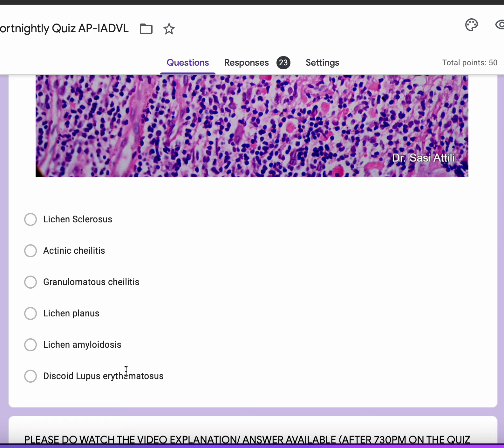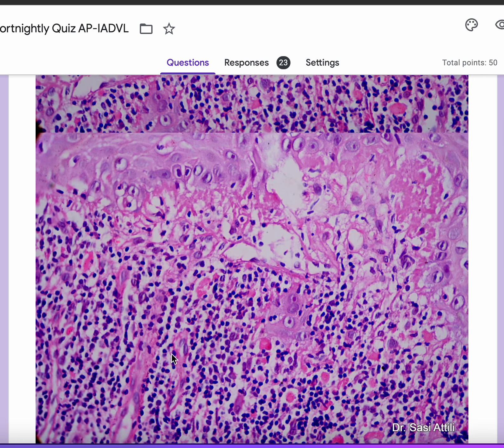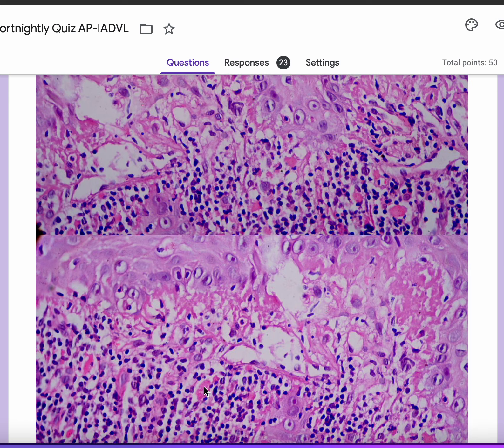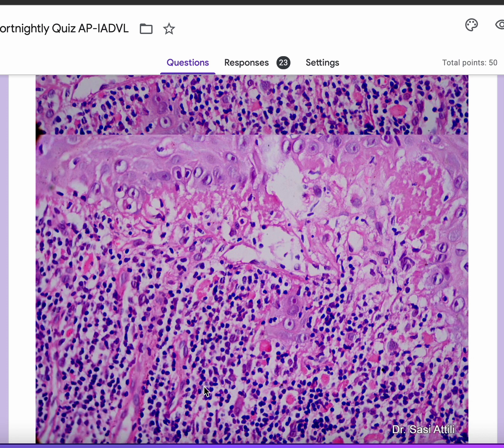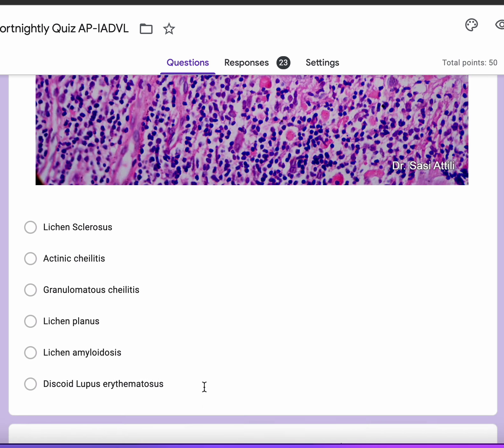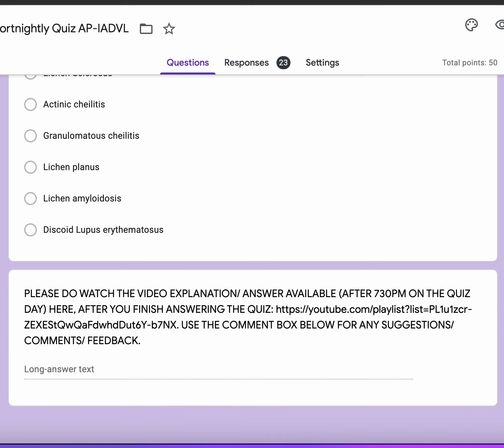DLE is a close differential — if you've chosen DLE, don't curse yourself too hard. DLE and lichen planus probably can be the differential, but DLE would show less dense lichenoid infiltrates, usually a bit patchier, more in the way of basement membrane thickening, and less in the way of colloid bodies. So this is a case of lichen planus of the lip. I hope you enjoyed the quiz — thank you very much.